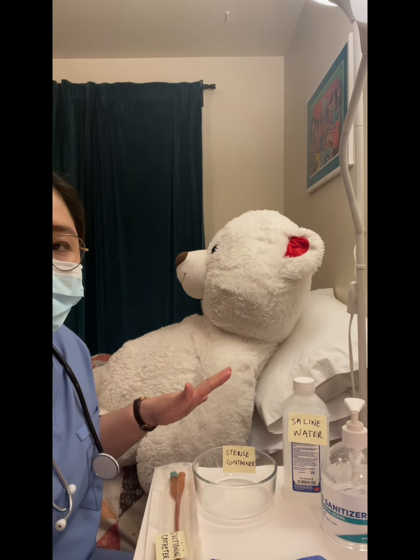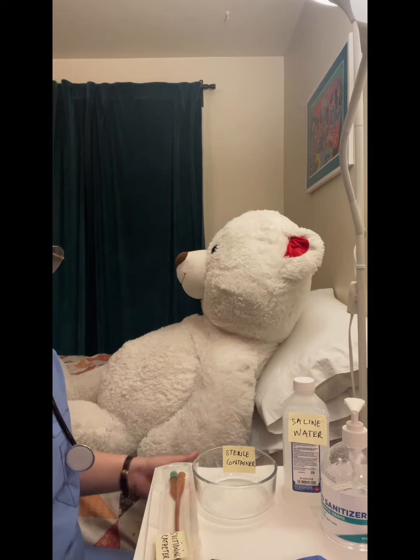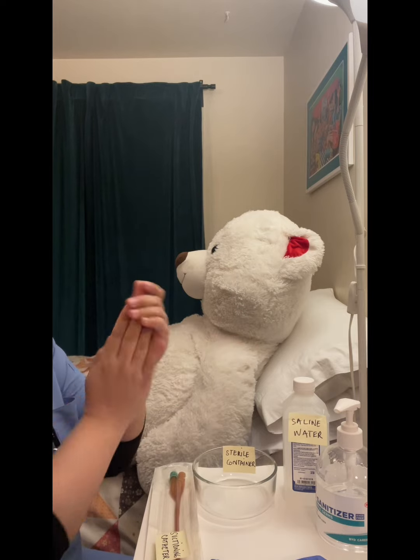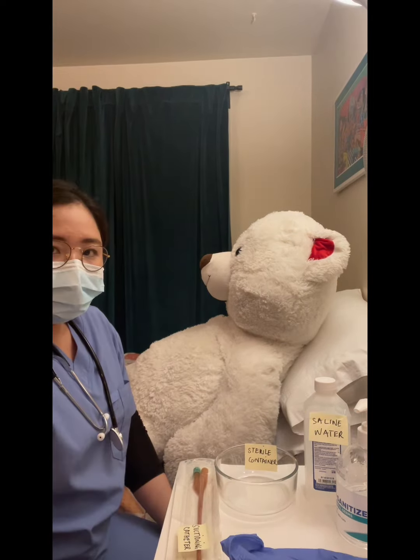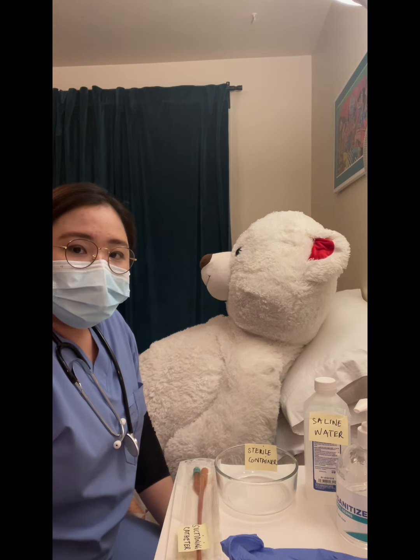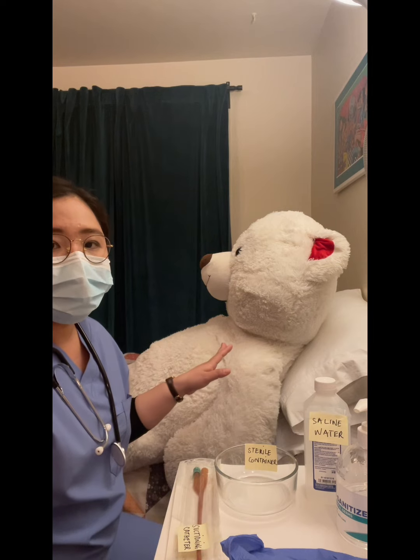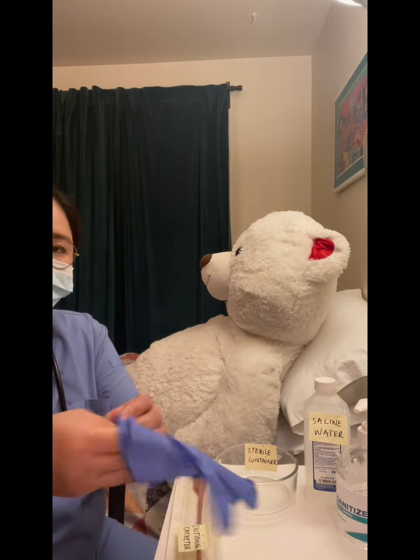So next I'll be doing all the preliminaries as I previously mentioned. And then I will perform hand hygiene. And then I will assist the patient in a comfortable position. In this procedure, the patient must be in a semi or high Fowler's position. And then I will put on the clean gloves.